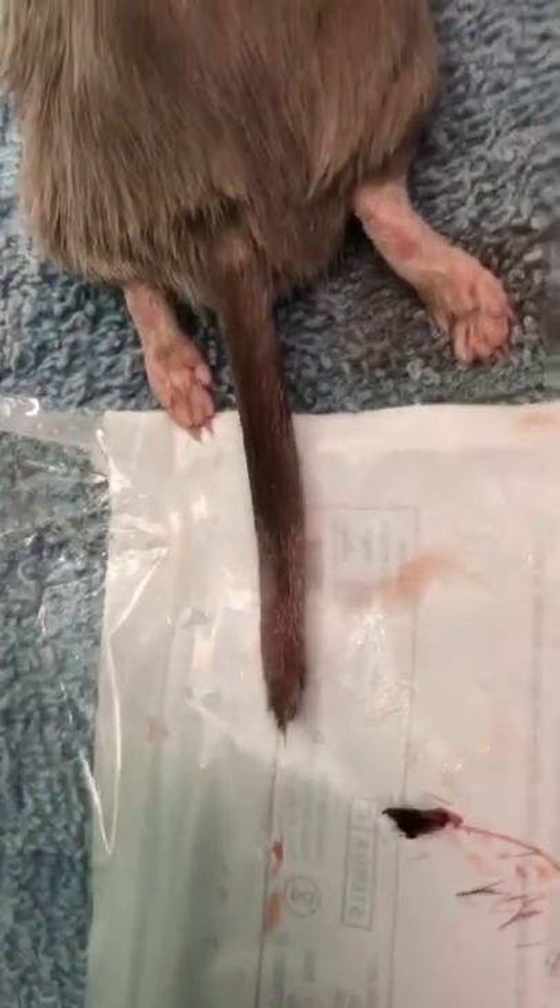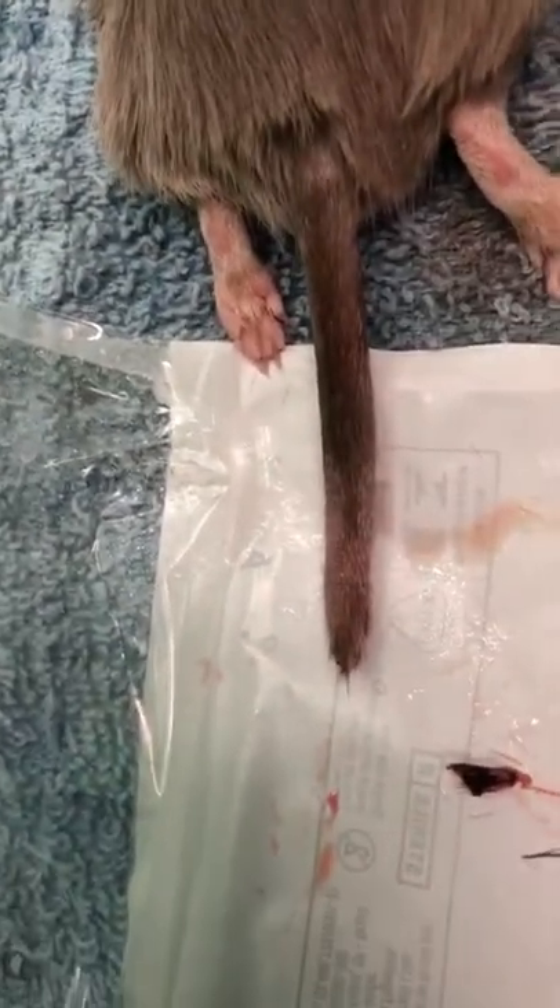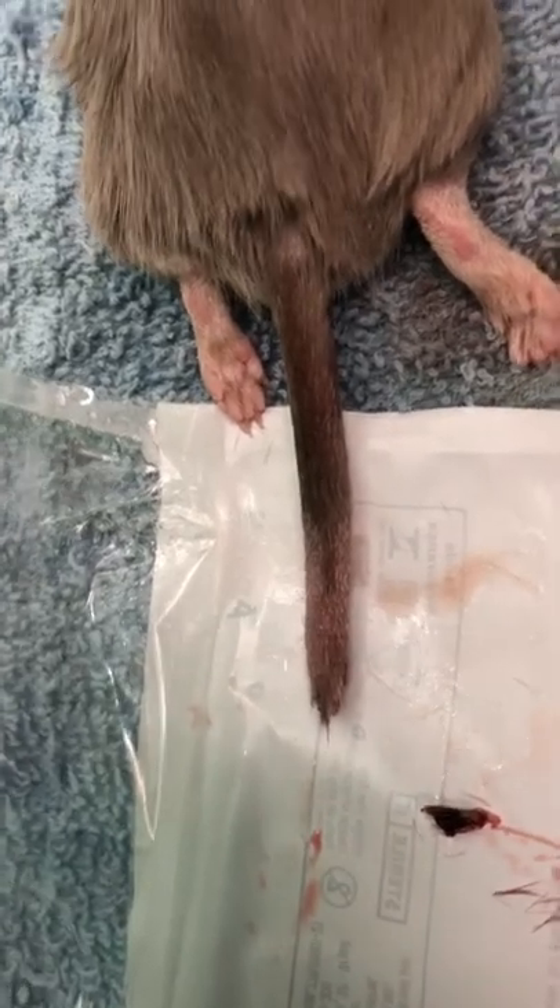So I removed a couple of coccygeal vertebrae and sutured the end of the healthy skin over top of the healthy part of the tail that was remaining.